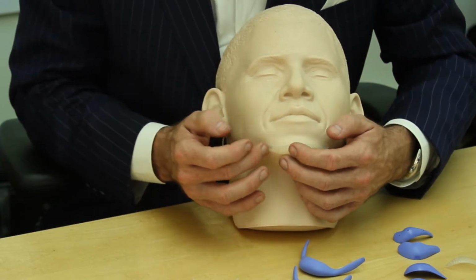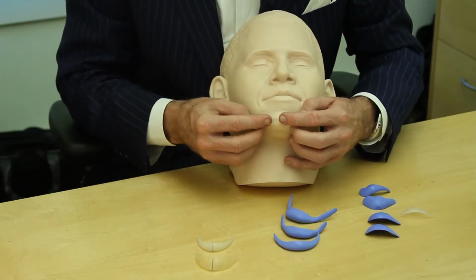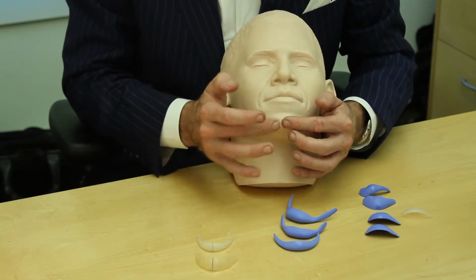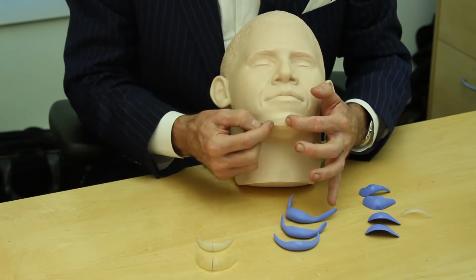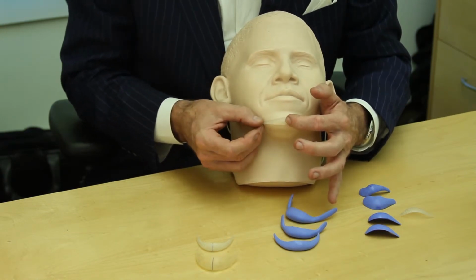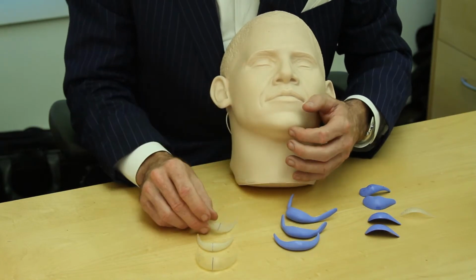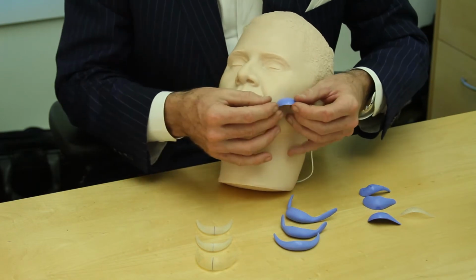So very commonly, if we're doing a lift and someone has a weak chin, I'll use one of these anatomical implants to give them a little bit more chin projection and also to fill in the space here where the pre-jowl is. There is a design also where we don't do any augmentation right here in the middle where I'm holding my finger, so it has no thickness here, but on the side there's fullness that comes out along and fills in what we call the pre-jowl sulcus, the pre-jowl dip right here that's evident in most people as we eclipse our 50s.